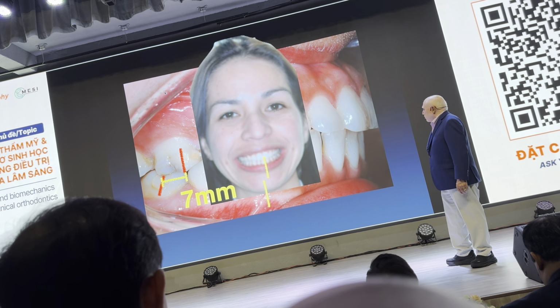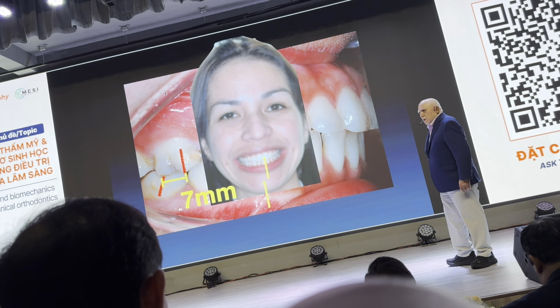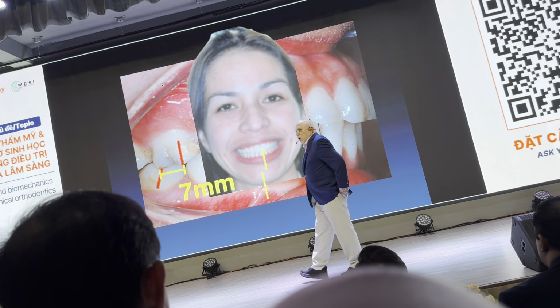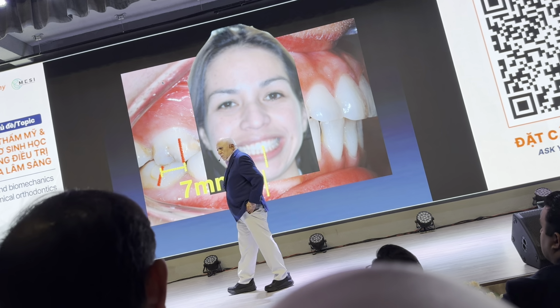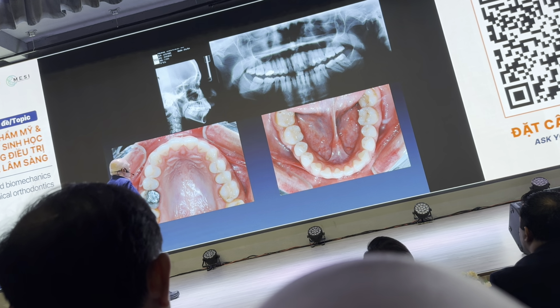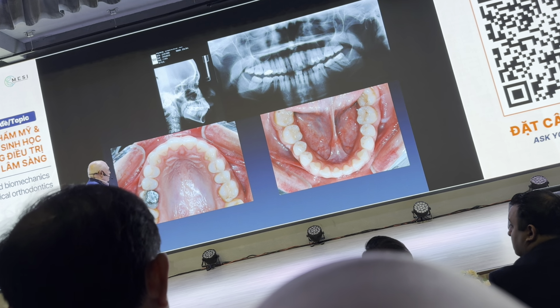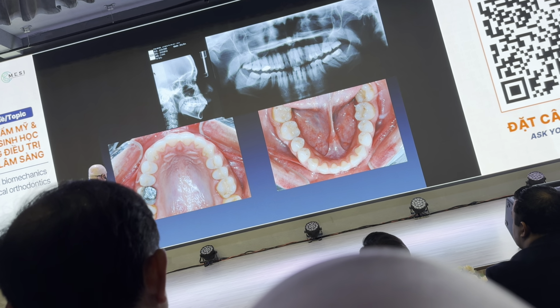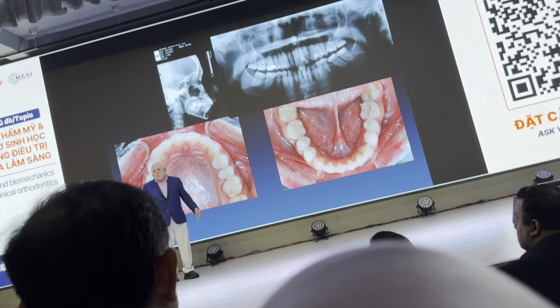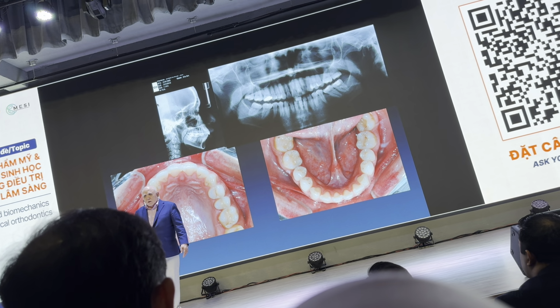We want to do this midline correction and the molar correction, non-extraction. Okay? So there's our patient. When you look at this arch form, you say, oh, this looks very nice.